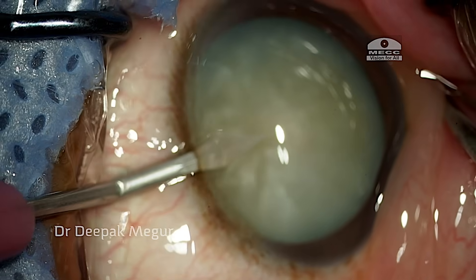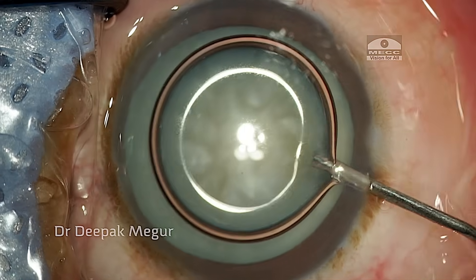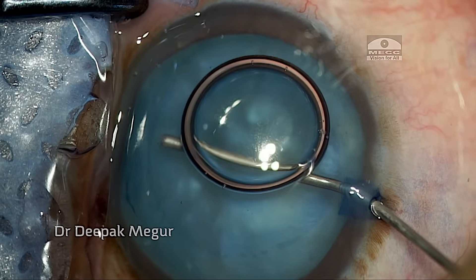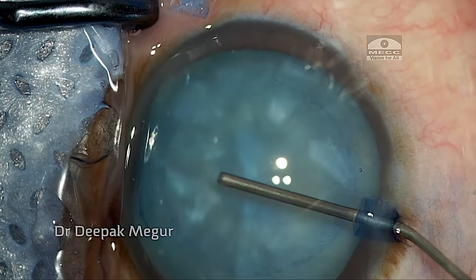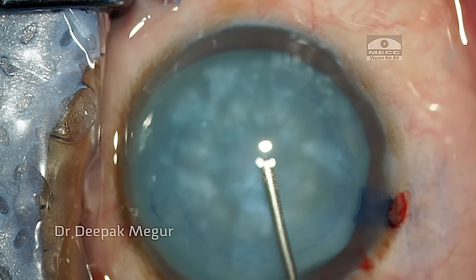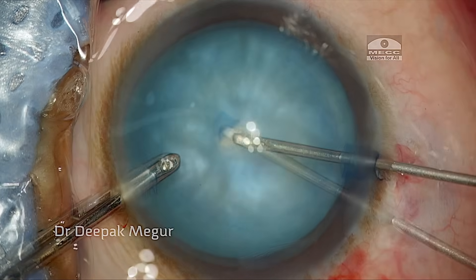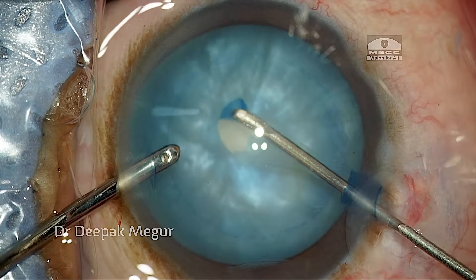Typically, two-staged CCC currently produces the most predictable outcomes in the majority of intumescent cataracts. I'm using purely dispersive OVD for intumescent cataracts, which is a slight change from the strategy I used to use.